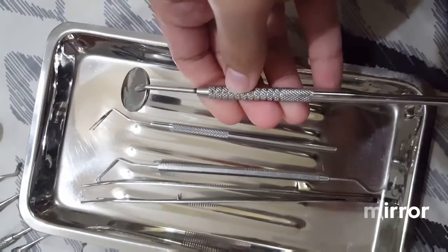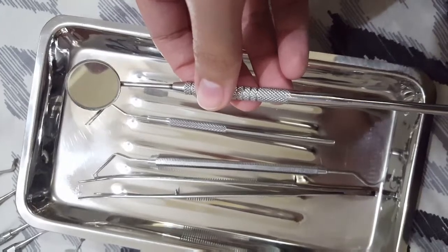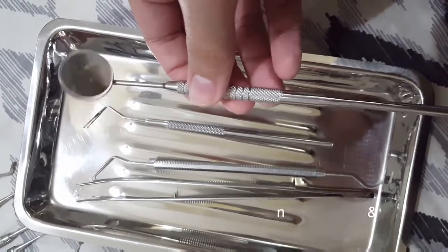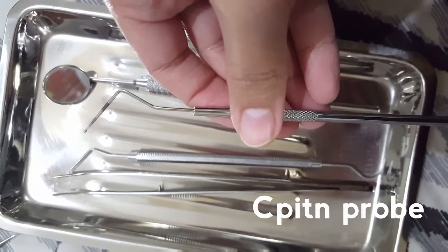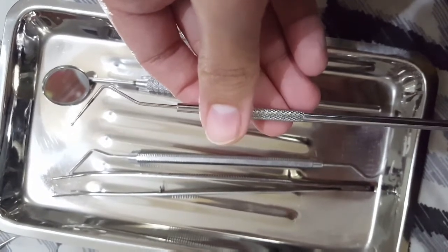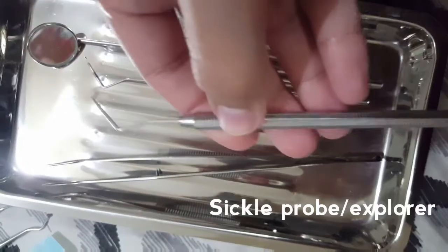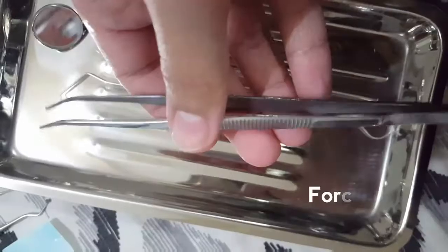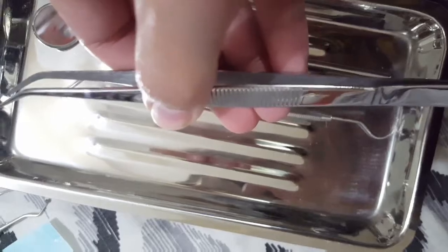First is the mouth mirror, which is the most common thing, and it is used for looking at tooth surfaces in direct and indirect vision. This is a CPITN probe. This is not commonly used in operative procedure. It's usually used in community dentistry, but sometimes it's required for measurements. This is a sickle probe or an explorer. This is also used. It's part of the examination set, and this is our good old forceps to pick up things like cotton swabs and all that.